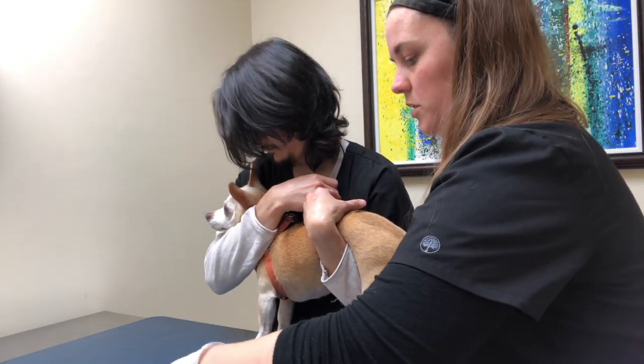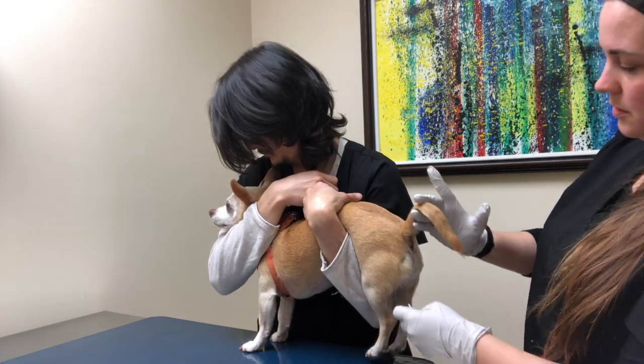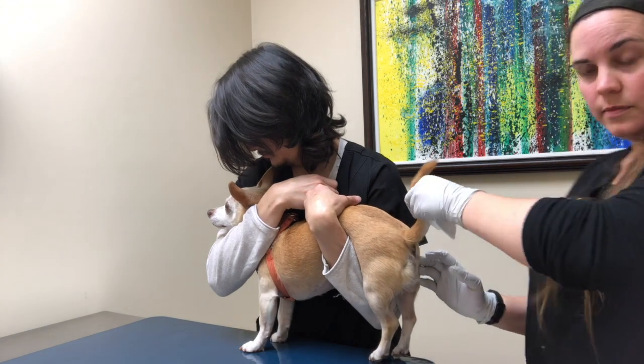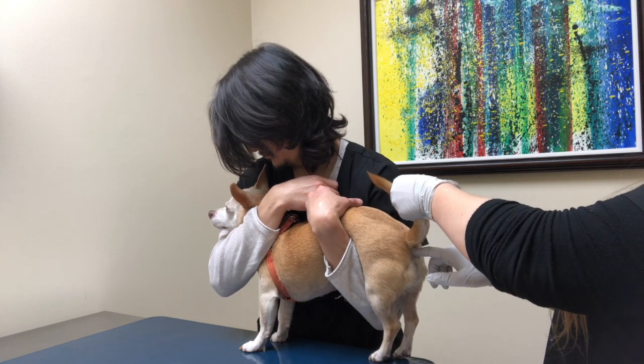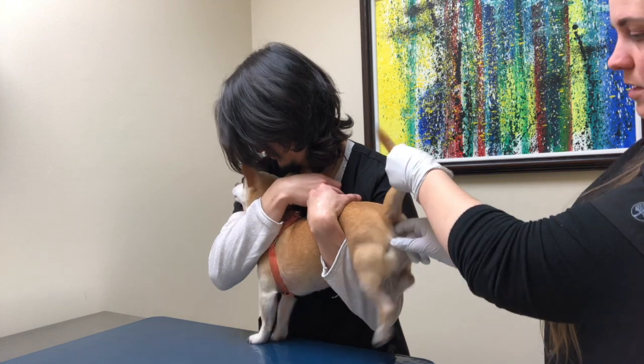And my other hand I'm going to have on the outside with a little piece of gauze. So we lift the tail and insert, and the anal glands are going to be at about 8 and 4 o'clock on the inside. So gently and slowly insert, and they feel like little grapes.